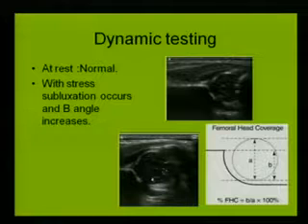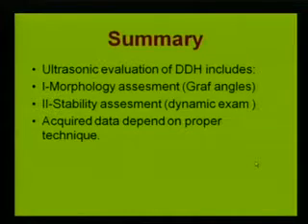So with stress, adduction, you see what happened. Here, the femoral head is becoming subluxed. It is not dislocated, but it is subluxed. And you can be sure of the presence of subluxation by measuring the equator sign and the degree of femoral head coverage.